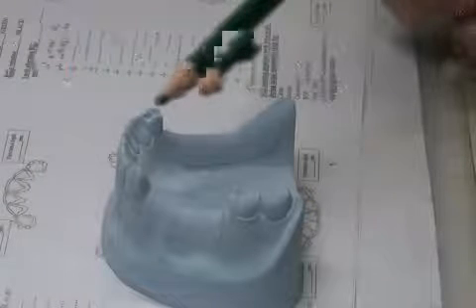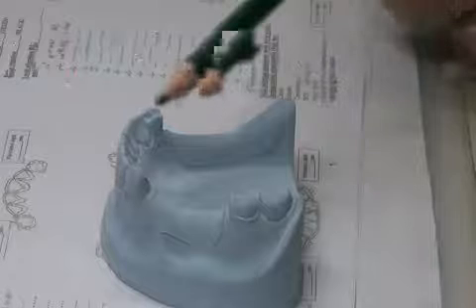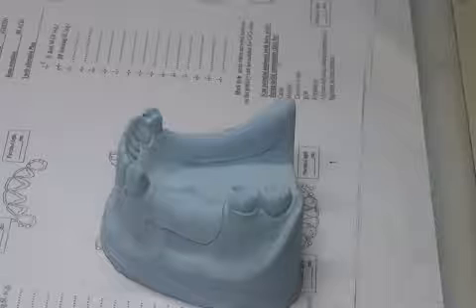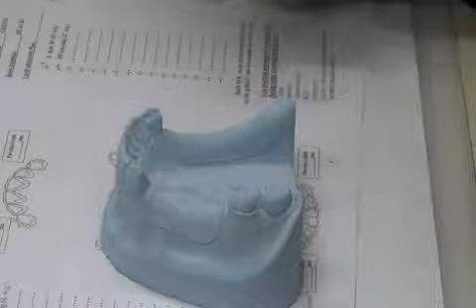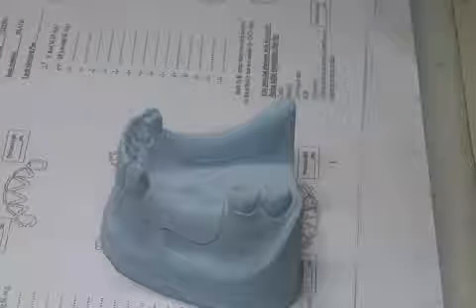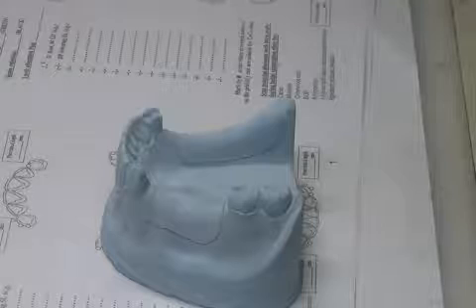But in action, this also happens, and we place a mesh in bounded areas. The bounded areas are okay with mesh, and usually we don't have a lot of resorption. This is the idea about bounded areas. Not a lot of resorption happens. That means we need place for teeth, and we usually put mesh there. We don't find places to place occlusally to place the teeth in the interocclusal spaces. So this is the design. We changed from the original design to another design. Okay, ready? So the idea is now clear. One of the indications of changing it here is aesthetics. Okay. Let's move on now to the case.